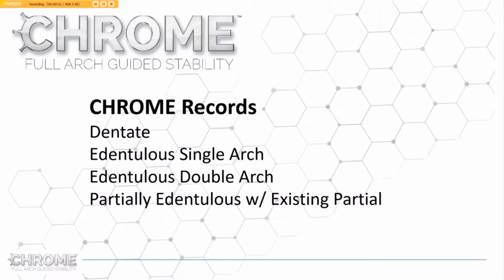In this video, we'll take an in-depth look at the records needed to begin a Chrome-guided smile case. Although the records by today's standards are very conventional, they are very specific and are necessary for each individual type of case that presents, so that we can launch Chrome correctly from the beginning.